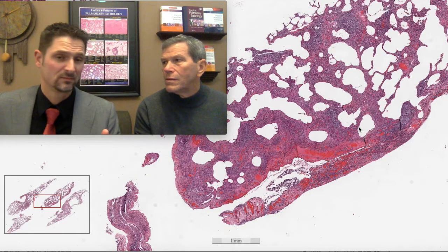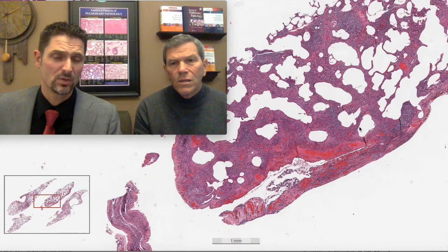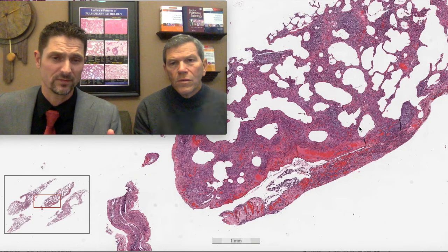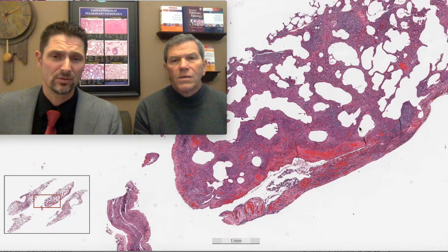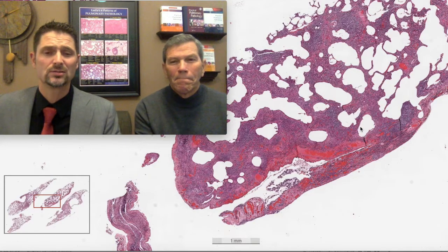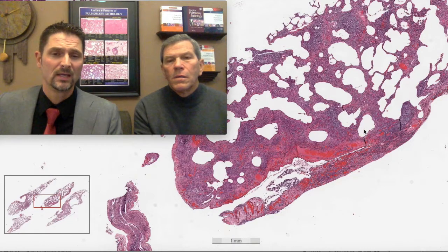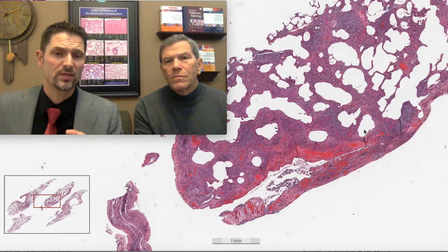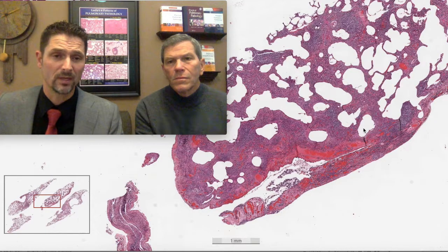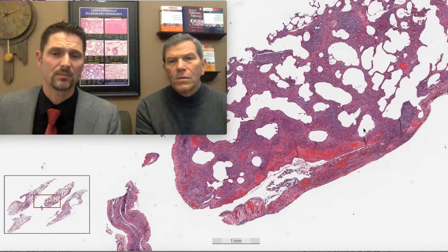LIP for the most part doesn't exist. You can practice in a very busy pulmonary pathology service your whole career and never use the term LIP safely, and you'd be doing just fine. Right. Okay, so you can pretend that LIP is off the table as a possibility. If you see something that you think you might want to call LIP, it's your job to make sure there's no lymphoma there. So do your stains, CD20, kappa and lambda by in situ hybridization.